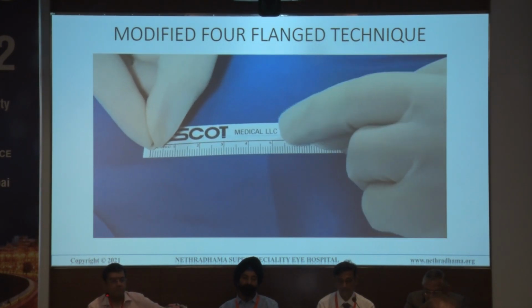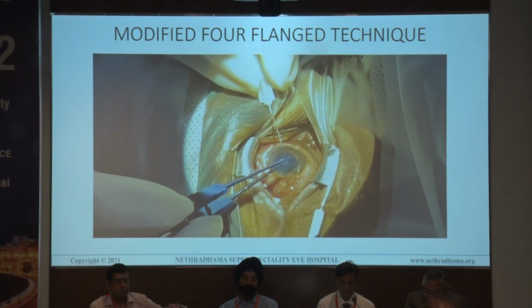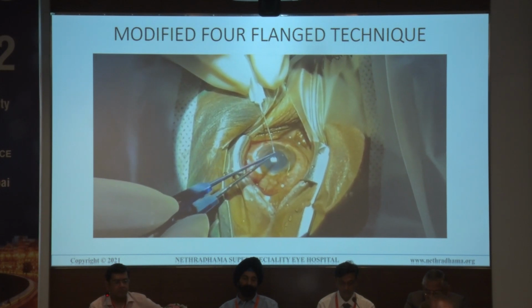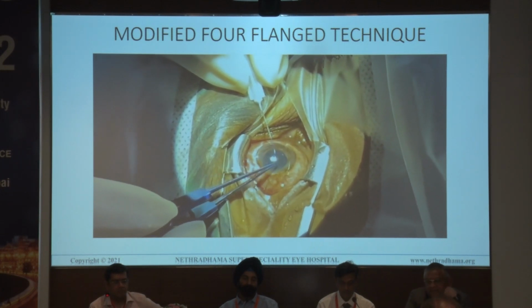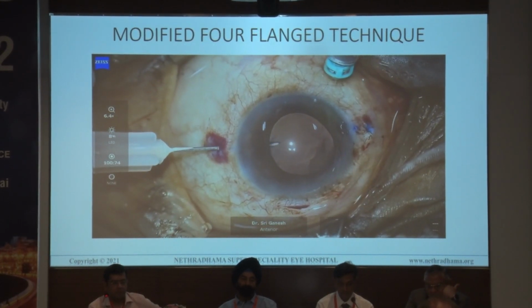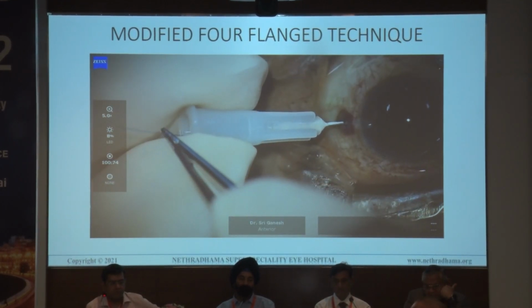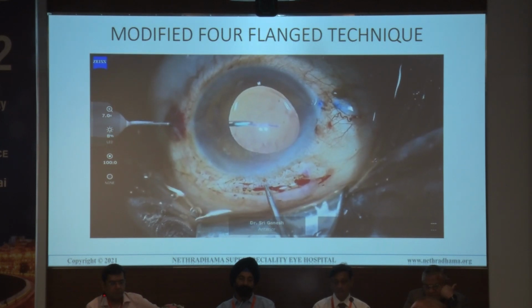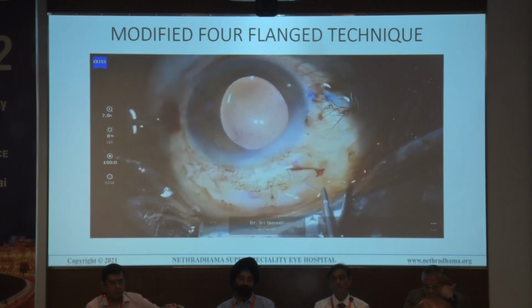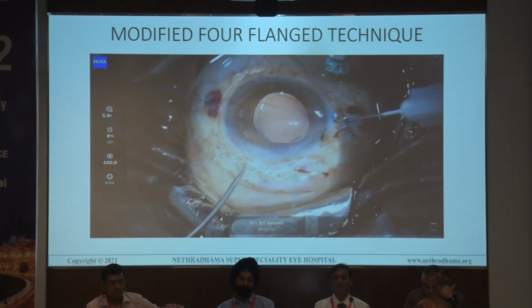Now this is the modified four flange technique. In this technique, the double needles are pre-prepared by feeding a 5 cm long strip of 6-0 prolene suture into the lumen of a 27 gauge needle. Under direct or microscopic visualization, the needle is then introduced into the sclera 1.75 mm from the limbus. The suture is advanced within the shaft of the needle. Once the suture is visible in the anterior chamber, it is grasped with a microforceps and exteriorized. The same is repeated on the other side, 180 degrees apart.